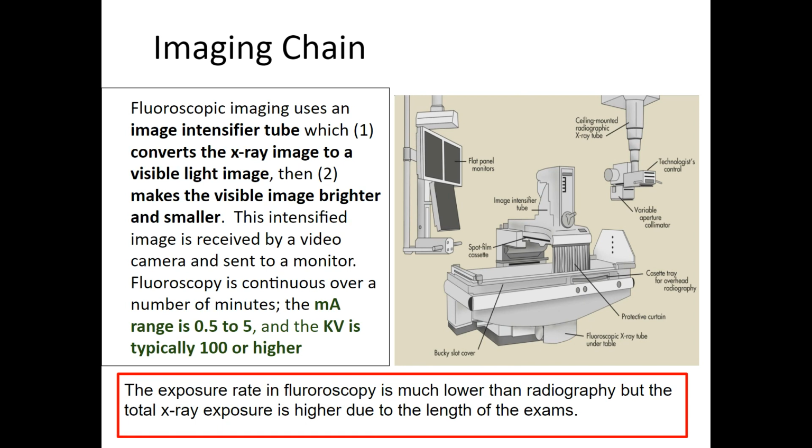So that's a good segue to talk a little bit about what's in a fluoroscopic suite or room. So we have some monitors. They're nice if they're flat. I actually remember big, giant, clunky monitors hanging from the ceiling, and I'm trying to remember if I was ever scared that the whole thing would just fall, because these monitors were gigantic. And they moved around, and luckily nothing ever happened. I think I'd be more scared now than I was then.